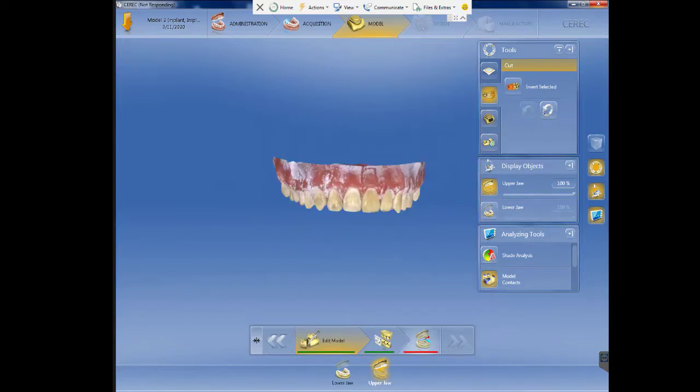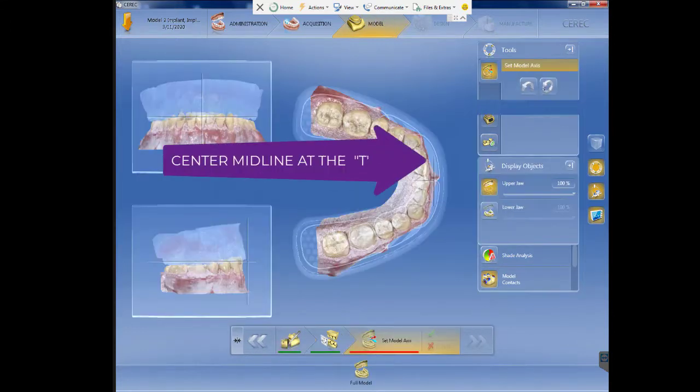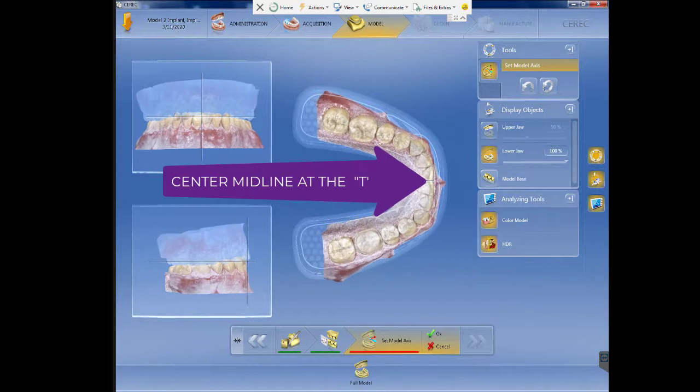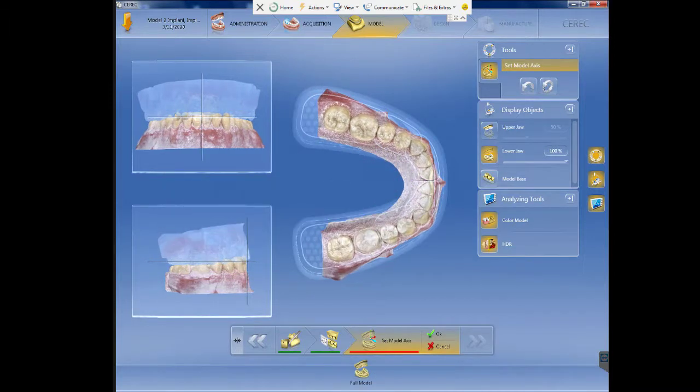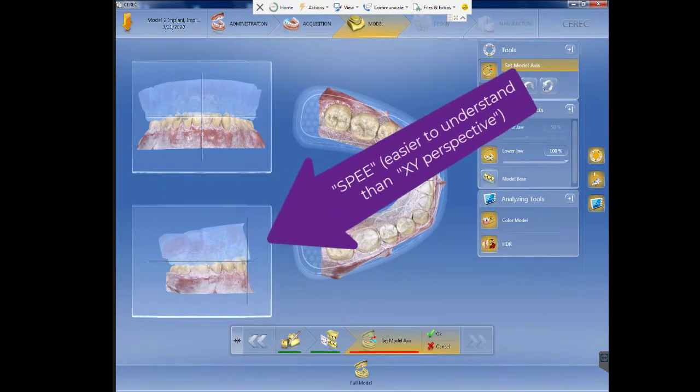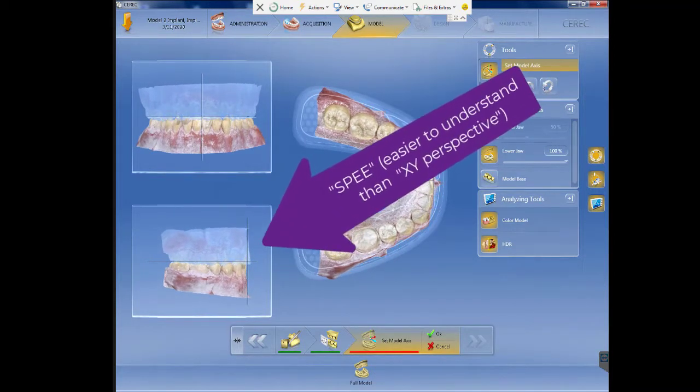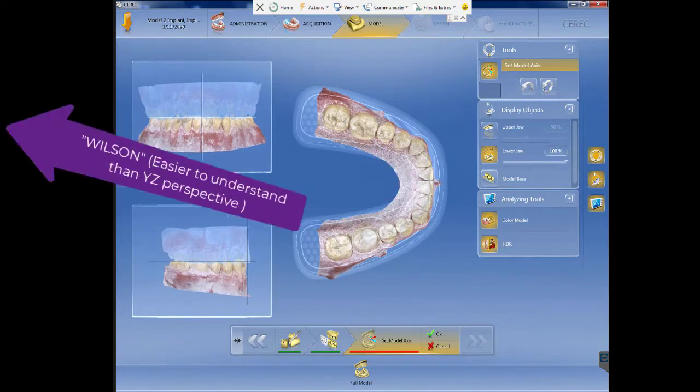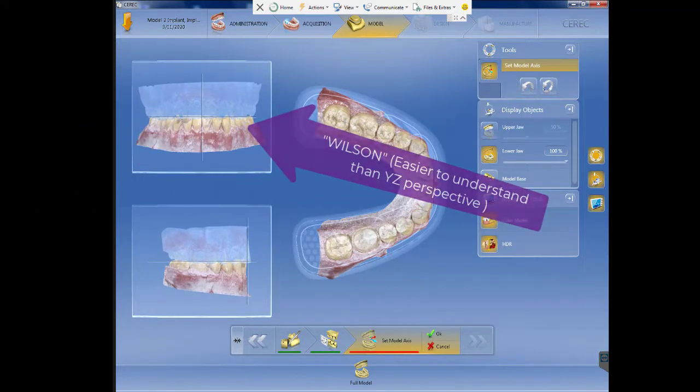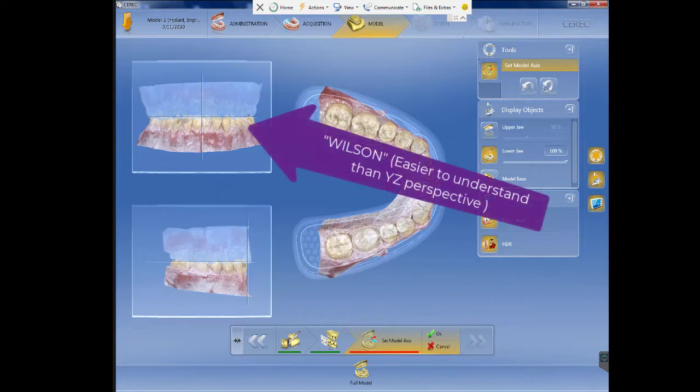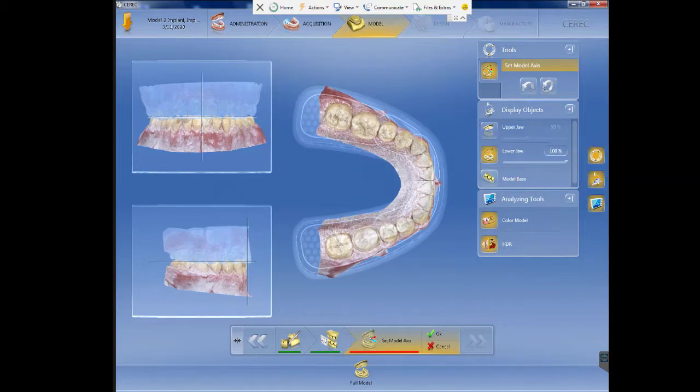Then position in the axial view your molars, your incisors, and your midline at the T. Then rotate the model in the occlusal plane on the lower left view. Then align your Wilson curve or frontal perspective. Now your models are mounted in the coordinates of your virtual patient.